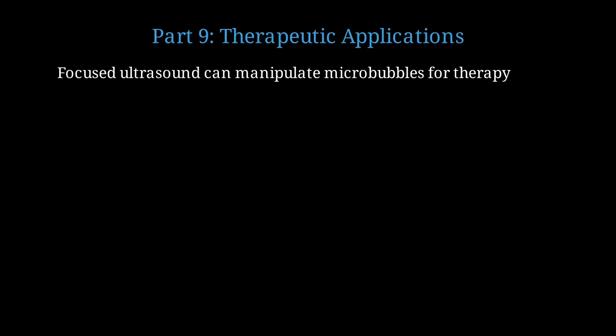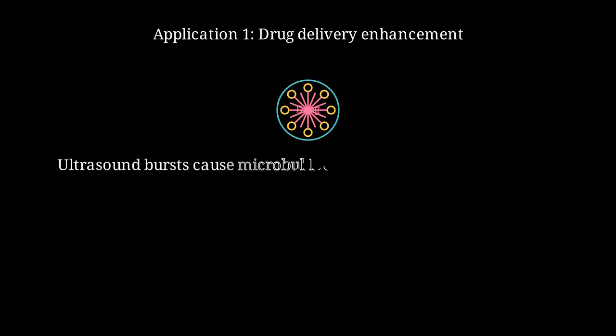Beyond diagnosis, microbubbles enable revolutionary therapeutic applications through acoustic manipulation. High-intensity focused ultrasound can manipulate microbubbles to deliver drugs, open biological barriers, and ablate tissue. First, microbubbles can be loaded with therapeutic drugs or genes and targeted to specific tissues. Drug-loaded microbubbles carry therapeutic payloads through the bloodstream to target sites. When ultrasound bursts are applied at the target site, microbubbles oscillate violently and eventually rupture. The pressure threshold for microbubble destruction ranges from 0.5 to 2 megapascals.